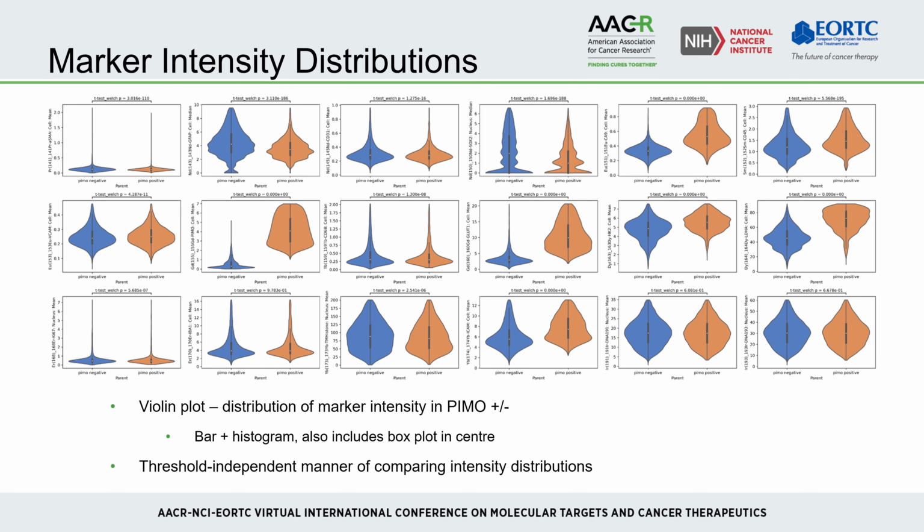But as many of these oxygen-dependent markers exist as a gradient rather than a binary expression, setting absolute thresholds may not be a sufficient method for evaluating their expression. Rather, we can compare the distribution of IHC marker intensities across our two areas and use statistical means to delineate whether or not there is a measurable difference across our two populations.